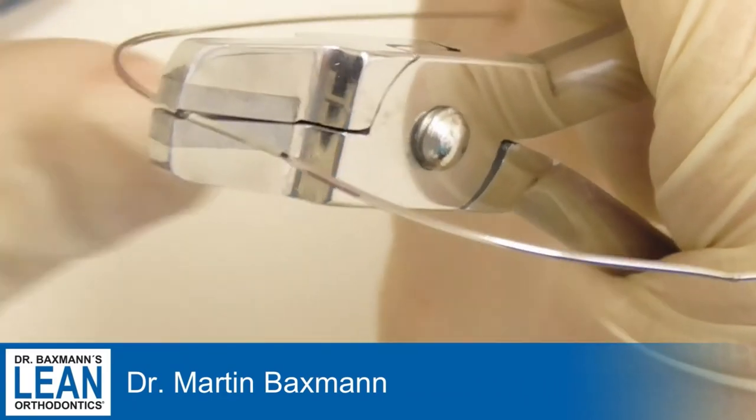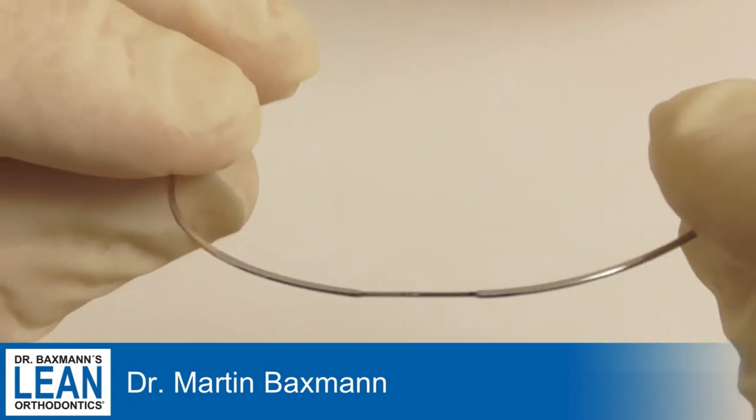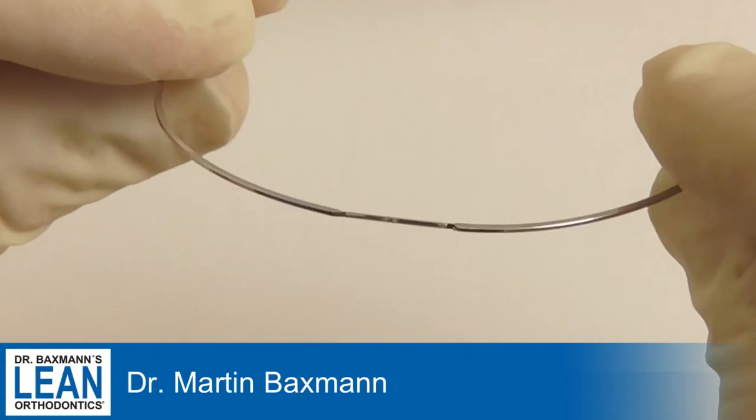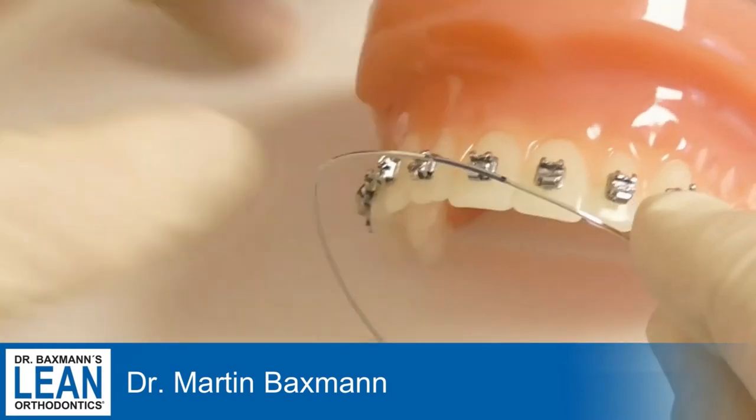You can see the torque angle by the angle of the plier that you hold. And that is the torque bend for one single tooth.